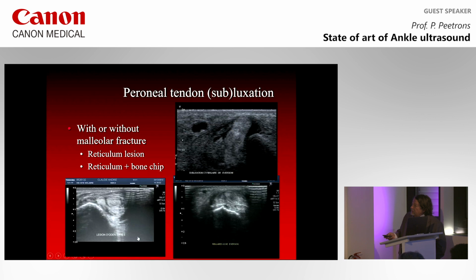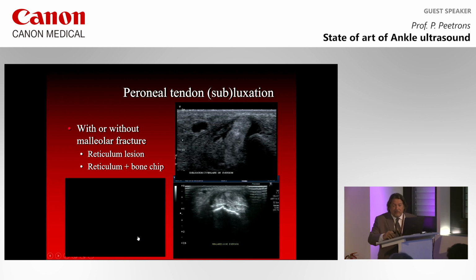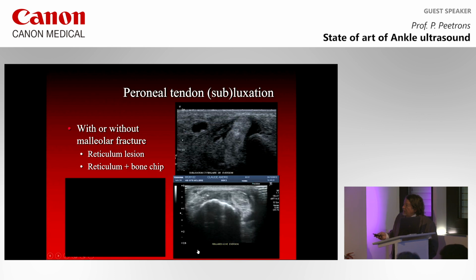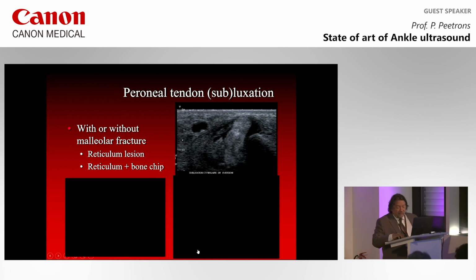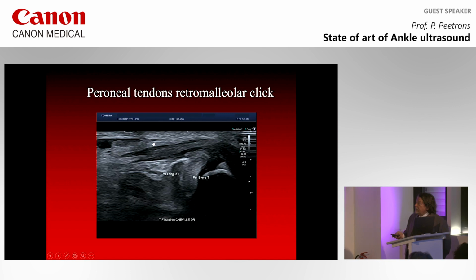And in some cases, you have something very special. You can see here the peroneus brevis, and you see a bony structure there. I don't know if you know what it is. It is a fracture. It is a bone chip coming from the fibula, and the retinaculum of the peroneal tendons is avulsed from the tip of the fibula. This is another example where you can see this little fracture of the fibula, and the peroneus tendons are going in between the fracture and the fibula. So this is a very important lesion. This must be treated with more than a simple band over the ankle, because this is a cause of recurrent lesions, recurrent dislocation of the peroneus tendon.